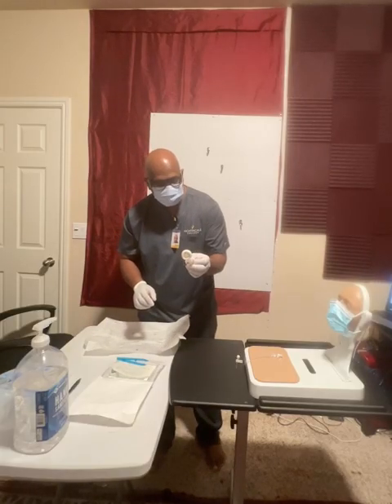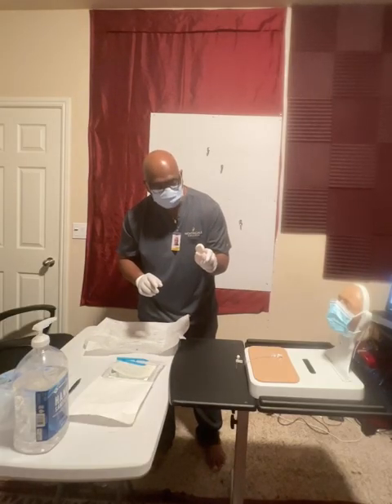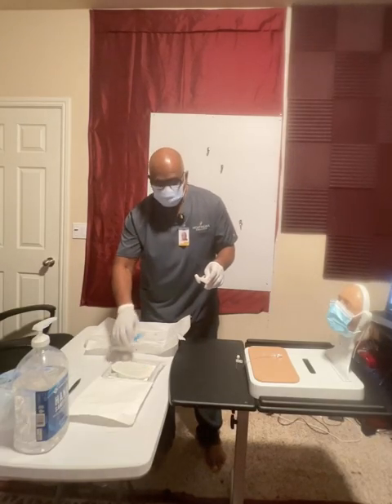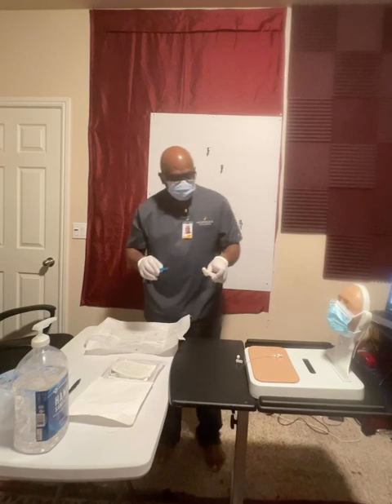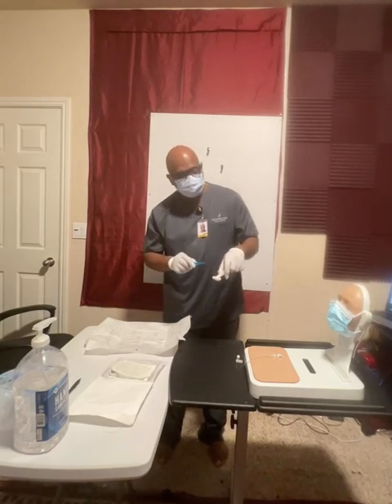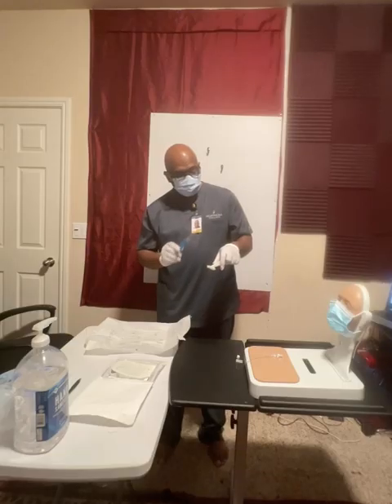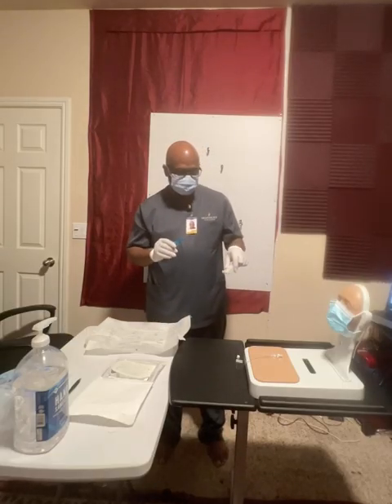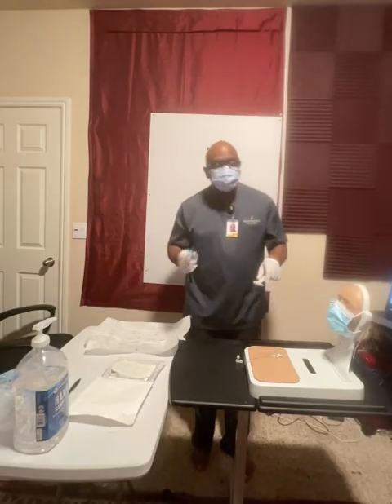On this device here, we're going to pop the clamps on the side just to open it up, and we're going to grab the forceps. The key to this one is to pop the clamp on the side to open it up. Also, we're going to make sure that the sponge on this device is soaked with the chlorhexidine cleaning solution, because that's how we're going to use it.